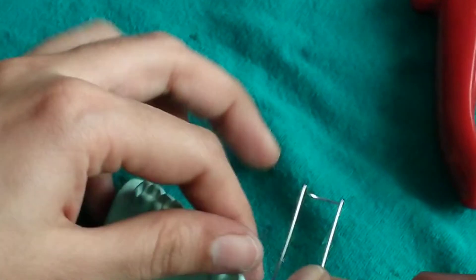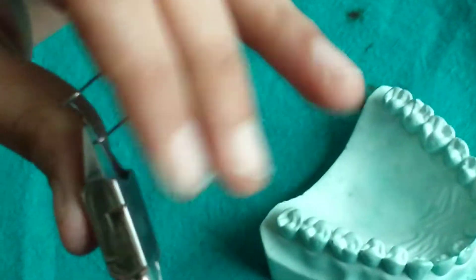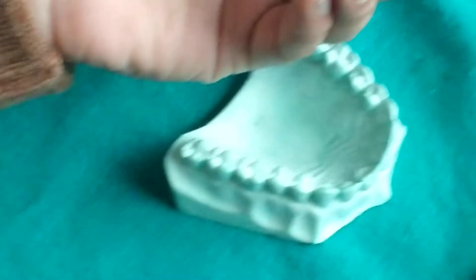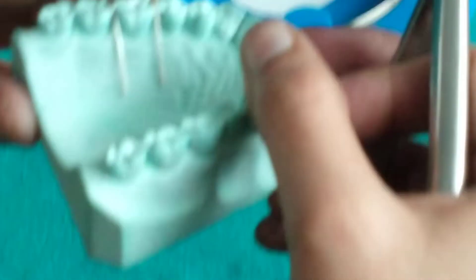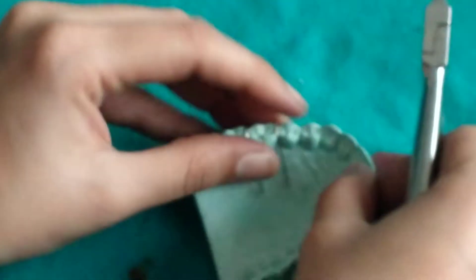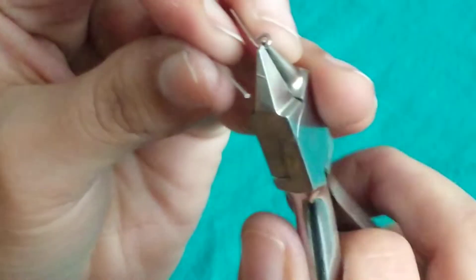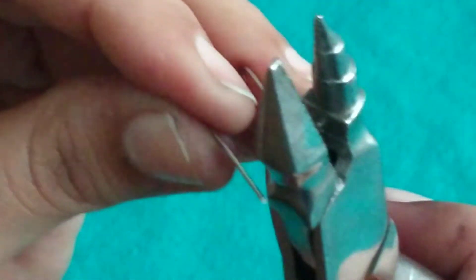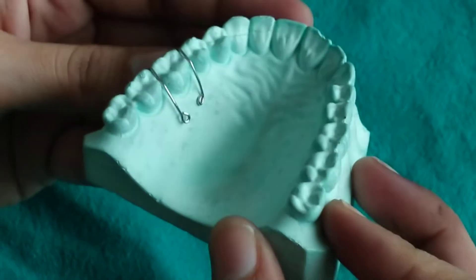We will be gradually adapting these palatal arms, the palatal retentive tags. After adapting the palatal retentive tags, we will give mesially facing retentive tags. This is a finely adapted U-clasp.